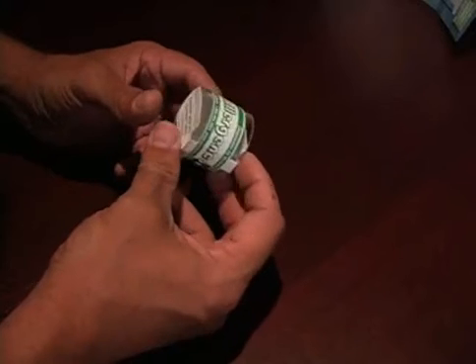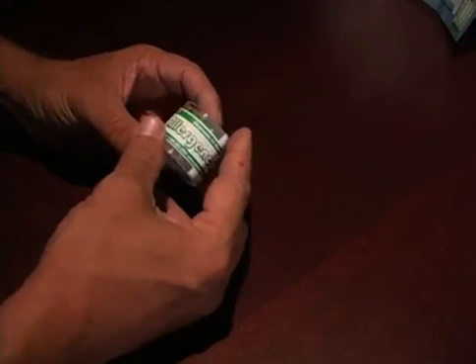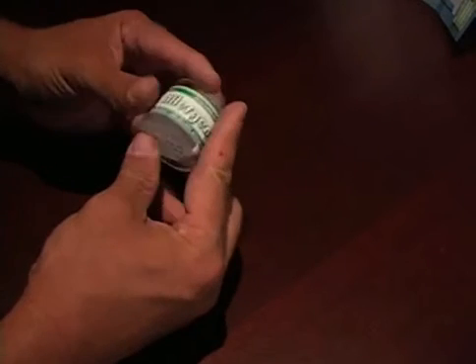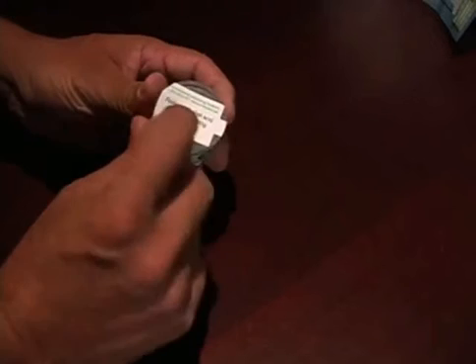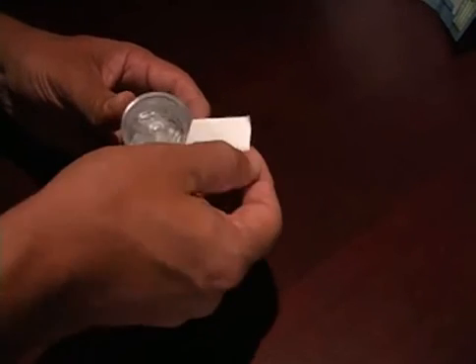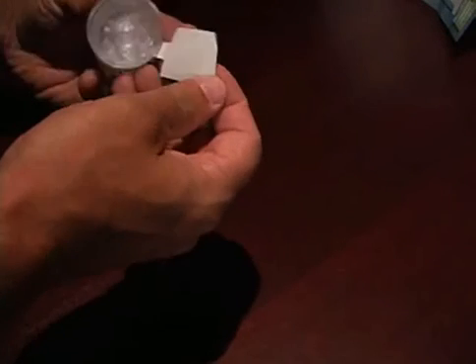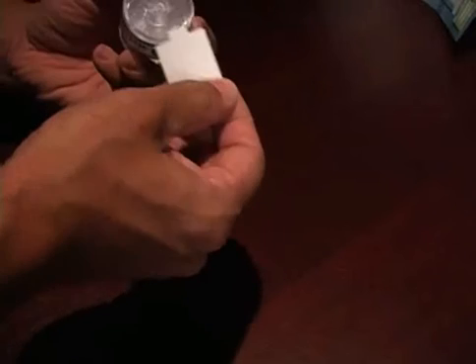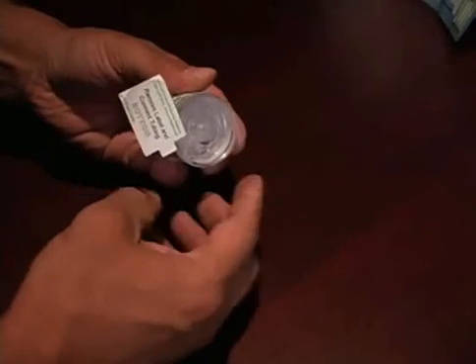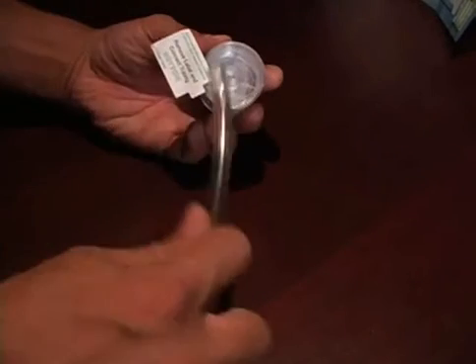And the way to do it is, it's labeled. This is the top, this is the bottom. It says bottom here, it says peel here. So you remove the bottom quality seal from the cassette, and you retain it. You can rip it off there and just put it on the side. So that's open. And then you attach your tube, your vacuum supply, to the bottom of the cassette. It fits directly onto it. No adapters needed.